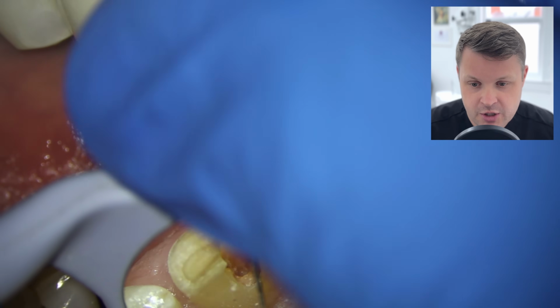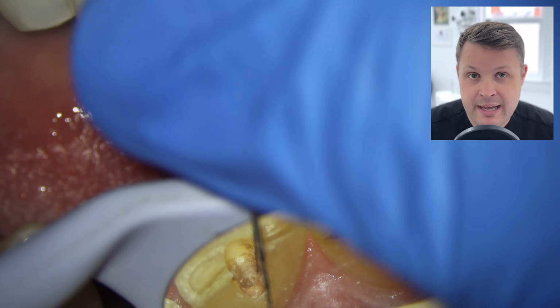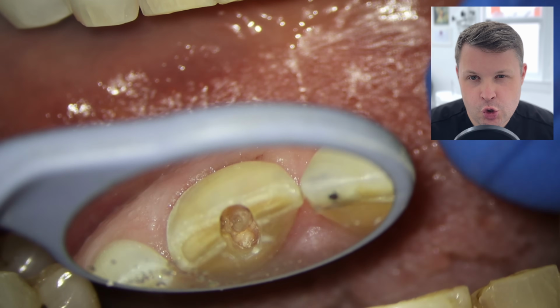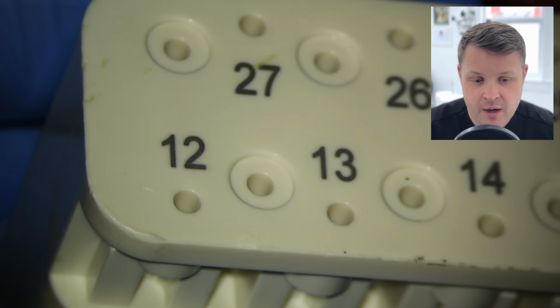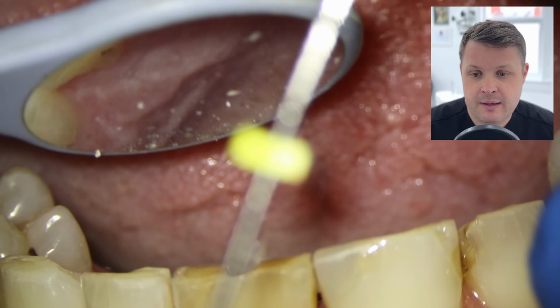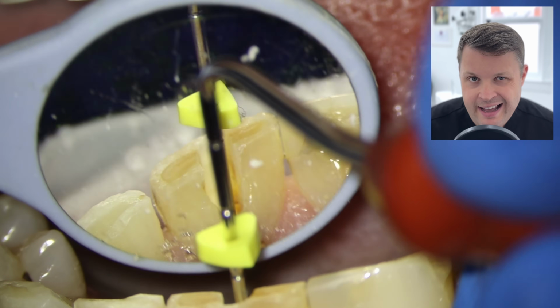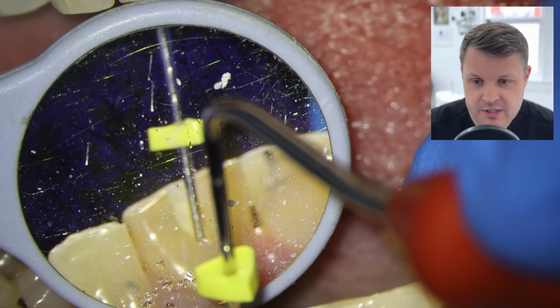So I'm going to have a little go with a hand file here just to have a feel around for maybe this kind of orifice, but I'm a little bit unsure about how deep I am, and sometimes it can be a bit disorientating how deep you are. So I am going to get my Mach 2 plugger, and I'm going to measure it to 12 millimeters. This is about the length where it should be, as seen on the cone beam CT scan, to see where the obvious canal space is.